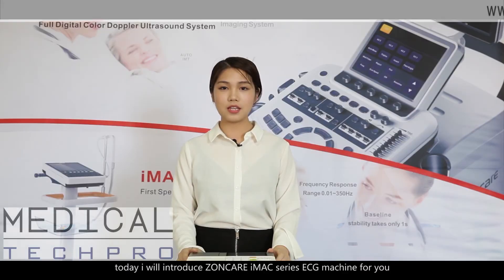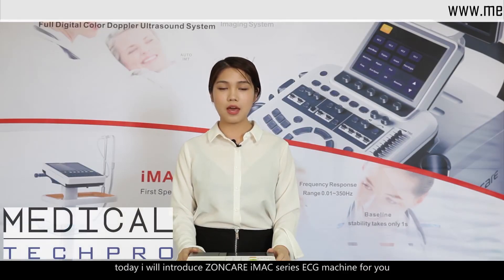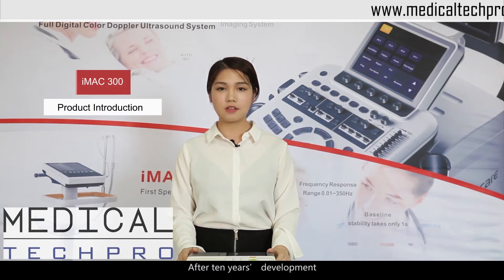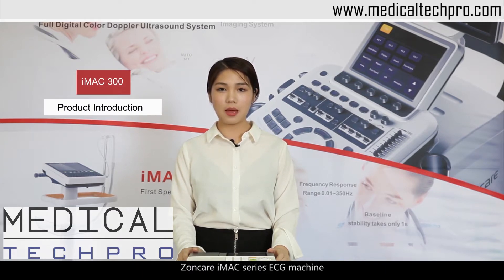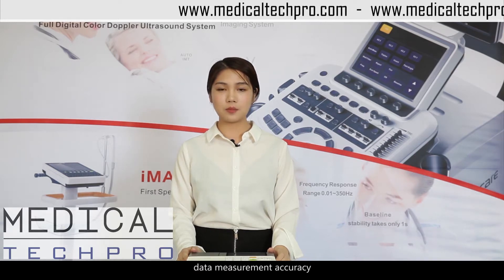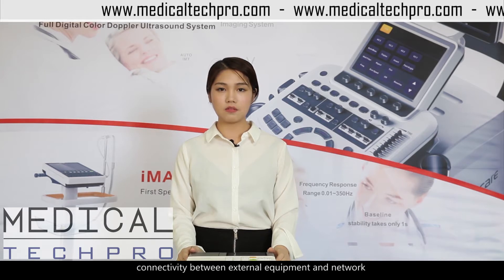Hello everyone, today I will introduce the Zoncare iMAC series ECG machine for you. After 10 years of development, the Zoncare iMAC series ECG machine has reached a world-class level in reliability and stability, data measurement accuracy, system response rapidity, connectivity between external equipment and network, unparalleled man-machine interaction and aesthetic design.